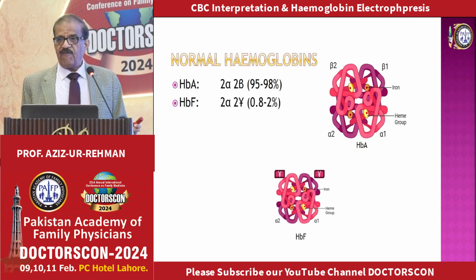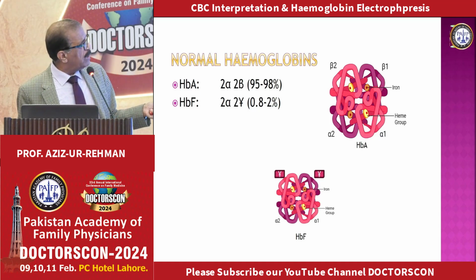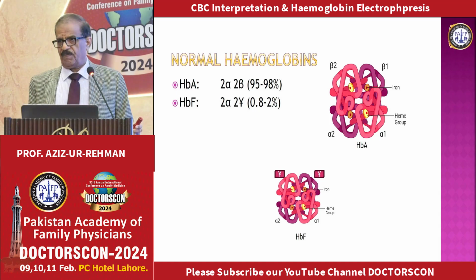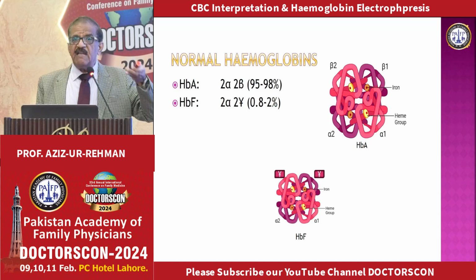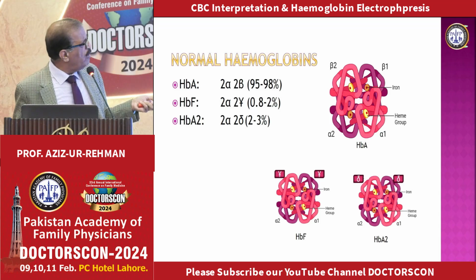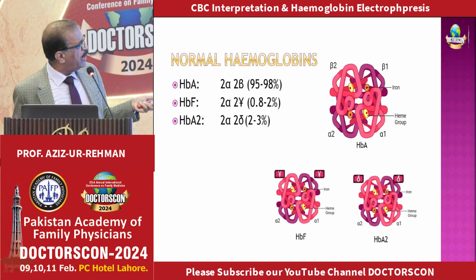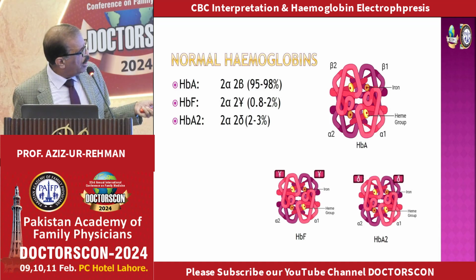Then we have hemoglobin F, which is the predominant hemoglobin in the fetus, but in adults also up to 2% there is hemoglobin F, which is 2 alpha chains and 2 gamma chains. This is normal hemoglobin. It works as normal hemoglobin, though it can be identified separately from A by electrophoresis. Then we have hemoglobin A2, which has 2 alpha and 2 delta chains. Up to 3% we can have this one. So here, fetal hemoglobin is 2 alpha, 2 gamma, and this is A2, 2 alpha and 2 delta.